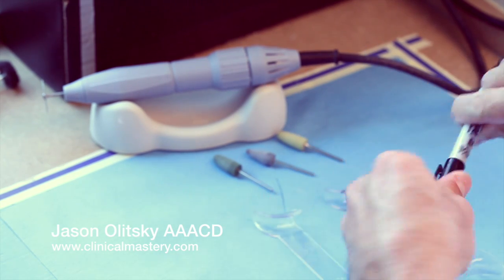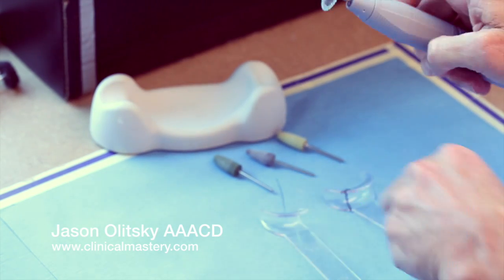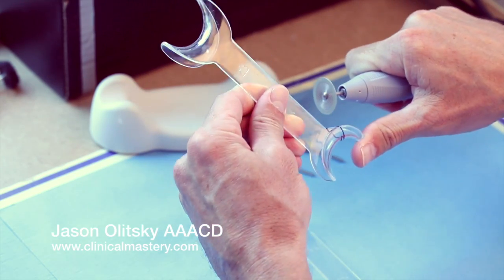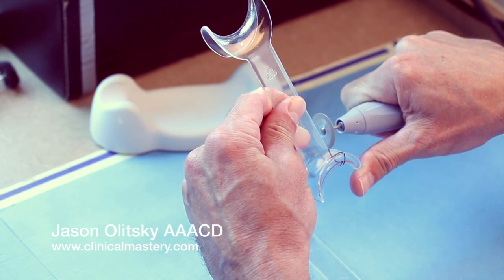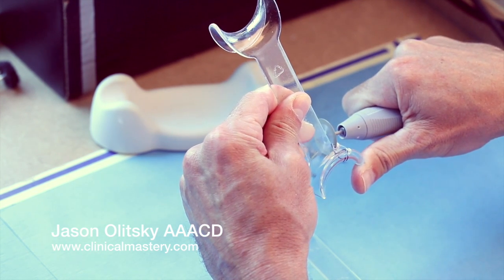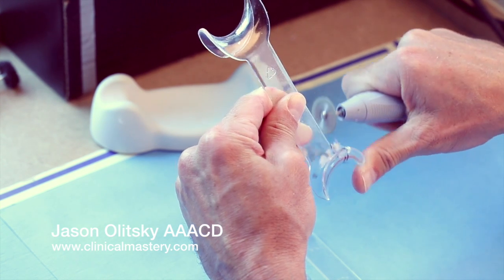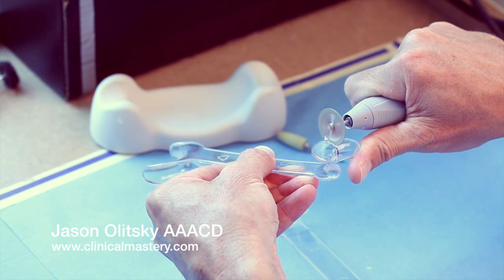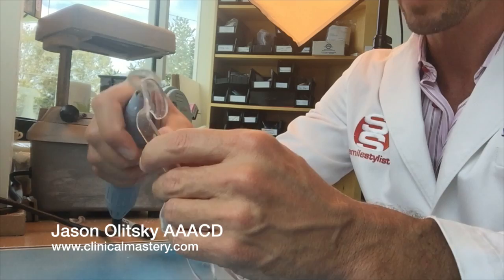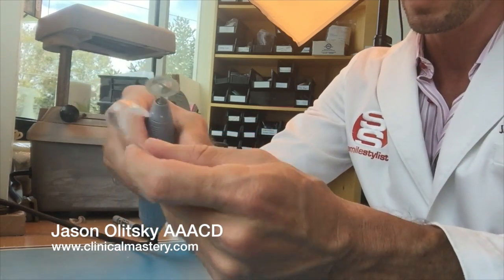That looks right to me. Now let's use a diamond disc in the lab with a nice mandrel, and I'm just going to follow the line that I've drawn. I've got a few little pieces hanging off there — I'm just going to grab those and peel them off.